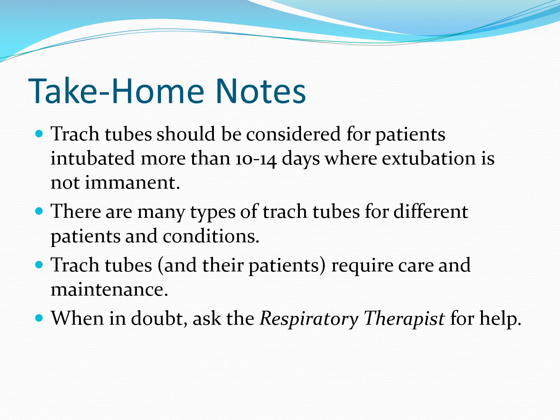So many, and by the way, even more than I've gone over in this presentation, but again, for the sake of covering key points in a relatively limited period of time, we've really focused on some of the most common variations. Trach tubes and the patients that have them require care and maintenance. So, simply put, it's a hole in the patient's throat.